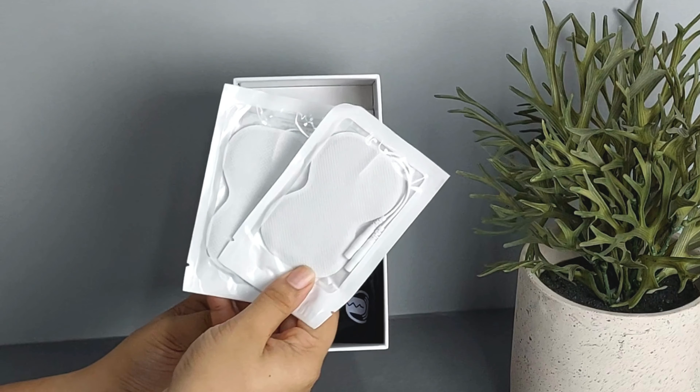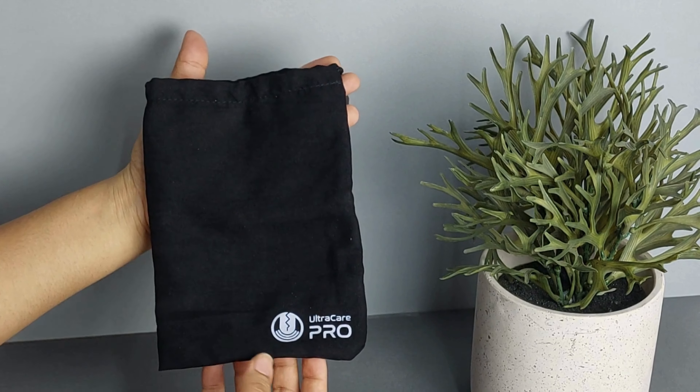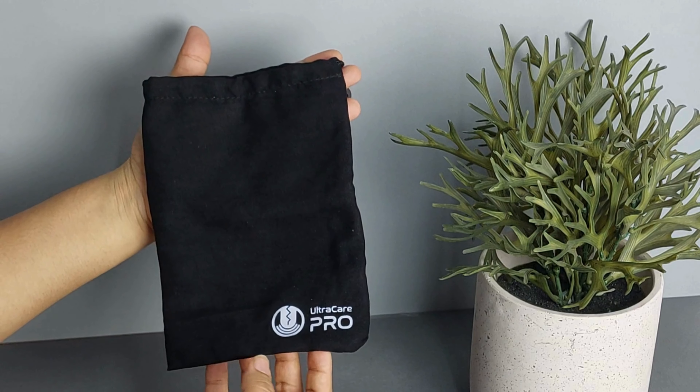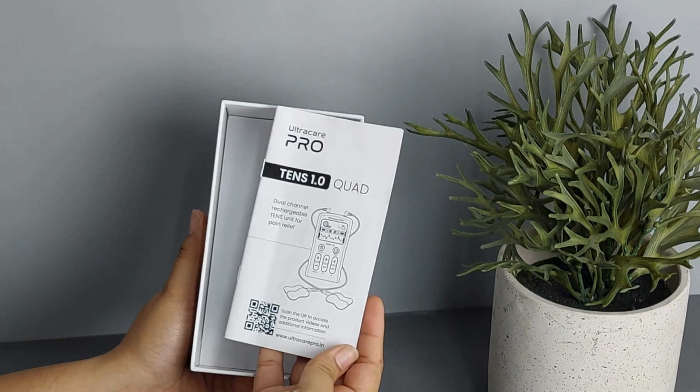Firstly, we have these 4 reusable electrode pads, then lead wires, a USB charging cable, finally a nice storage pouch to keep the product safe after every use, and not to forget an instruction manual to help you use the product effectively.